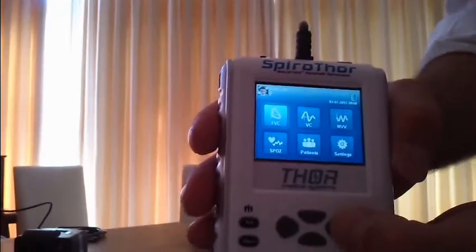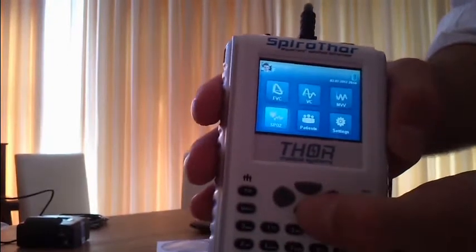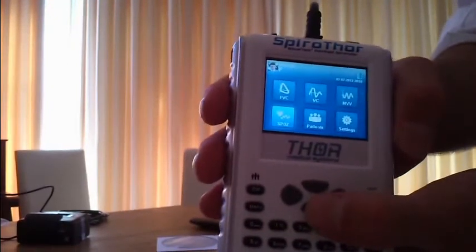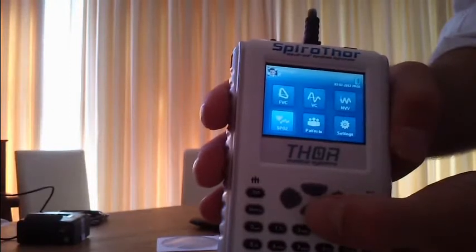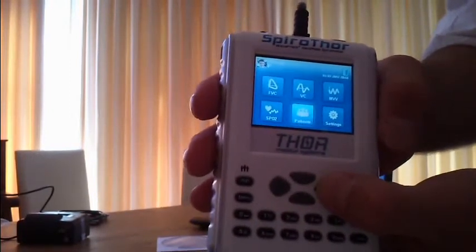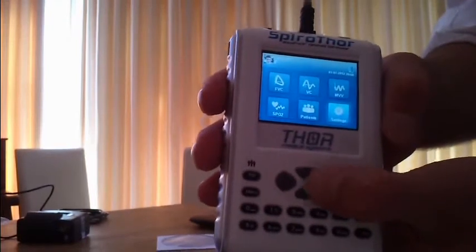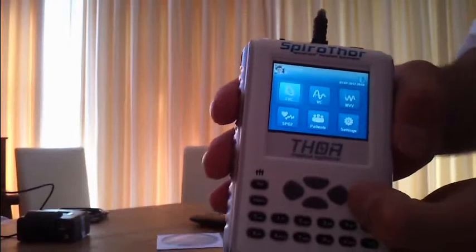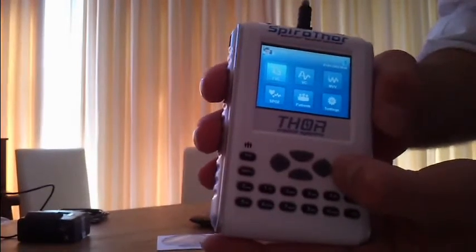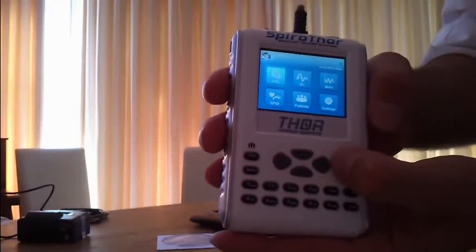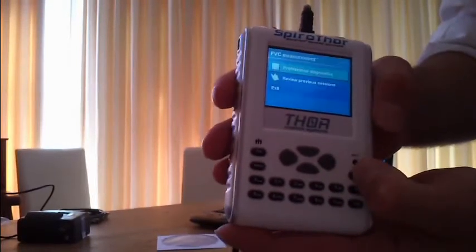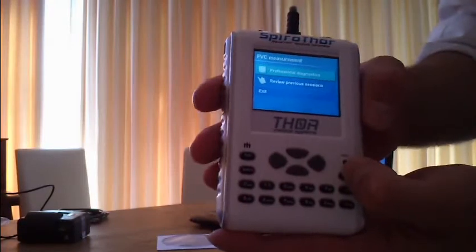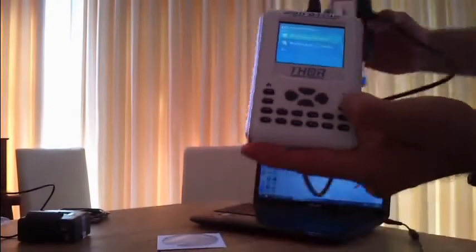You can see FVC, VC, MVV measurement, or SpO2 measurement if there is an oximeter connected to the device. We also sell this device with an oximeter connection. You can go back to patients menu and to the settings menu. The most simple and typical use is an FVC curve. I'm going to demonstrate how to do an FVC curve. You hit enter and go to professional diagnostics.